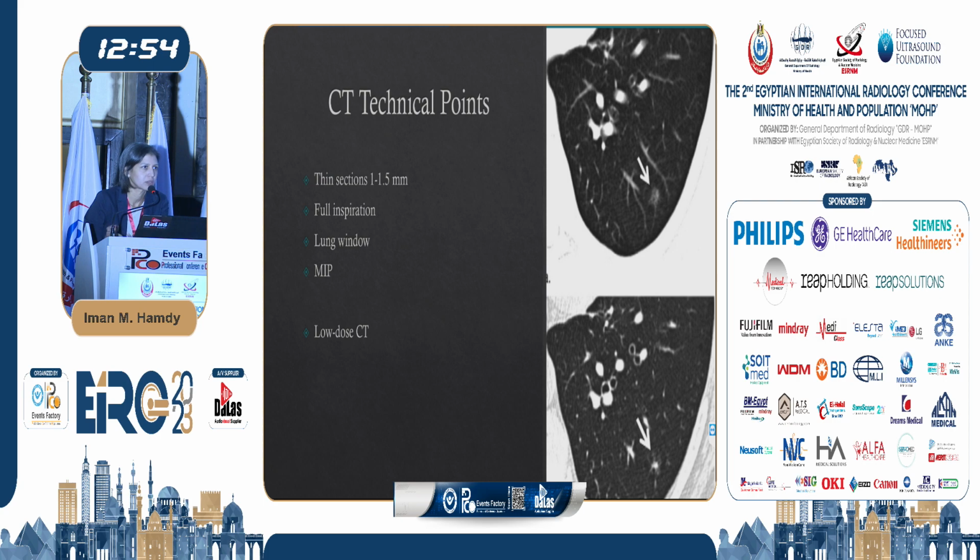We manage usually from the lung window and go to the mediastinal window for side findings. The MIP helps a lot in pulmonary nodules, and of course, as will be mentioned later in the screening, low-dose CT.